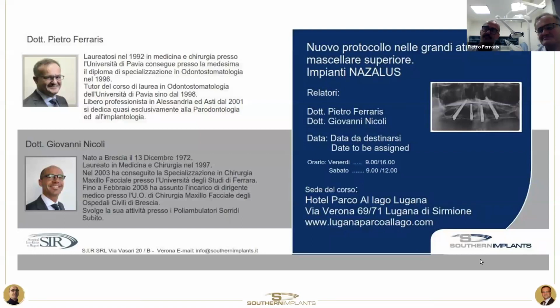Guy McClellan asked a question: how have you decided on 3 millimeters? The 3 millimeter rule comes from the concept of the biological width. Placing an implant and connecting it to an abutment defines the biological width, and we prefer to have bone around the implant, because hard tissues protect soft tissues and vice versa. Soft tissue is a covering for hard tissue. When you have less than 3 millimeters, you have to graft to protect the soft tissues and to avoid a future fistula. The graft does not guarantee the stability of the implants; it is only to give a long life to the implants themselves.